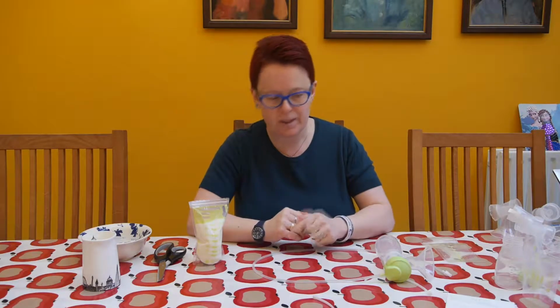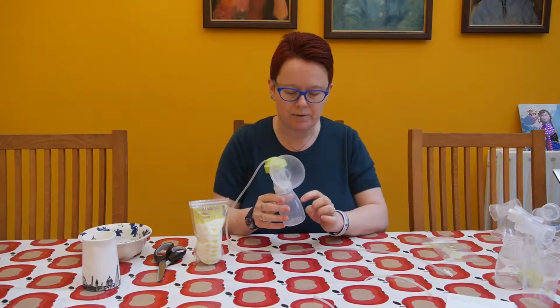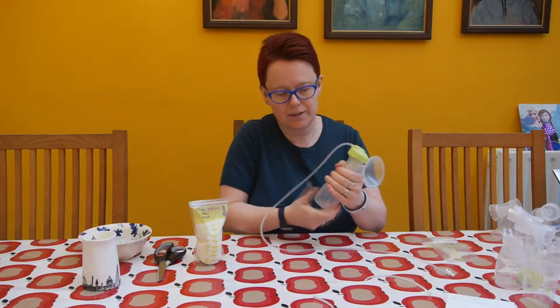So I'm going to talk to you about how to pump directly into a freezer bag using the Ardo Easy Freeze system, instead of having to pump into a bottle and then pour it into a bag in order to store it. So normally when we're pumping, we're going to be pumping directly into a bottle, but today we're going to use the Easy Freeze bag.